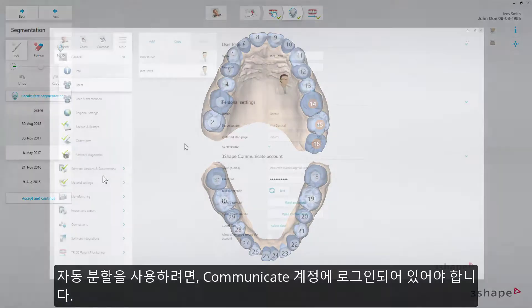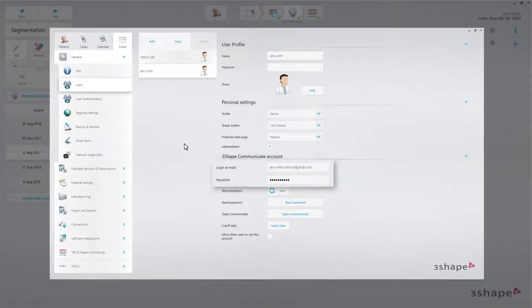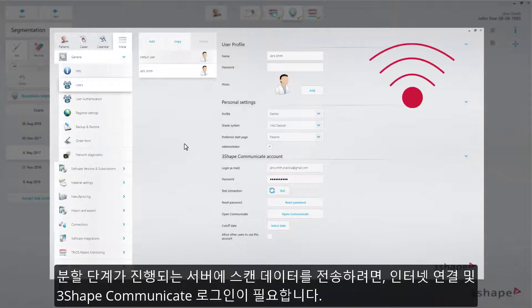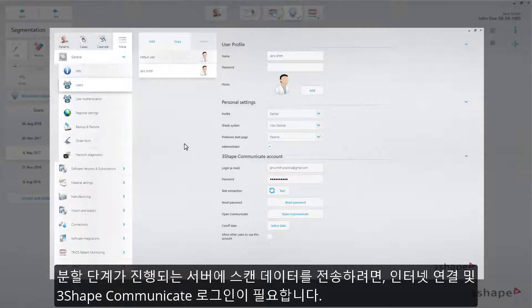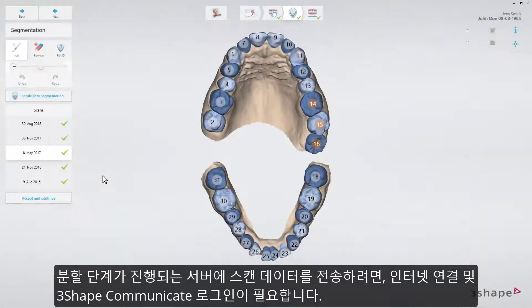To use automatic segmentation, please make sure that you have signed in to your Communicate account. Being signed in to Communicate and an internet connection are the two requirements for the user to be able to send scan data to the server where segmentation takes place.